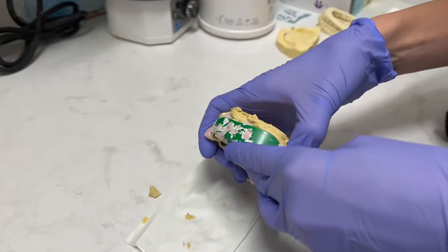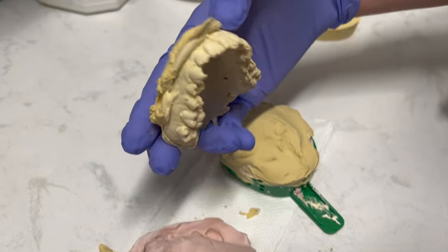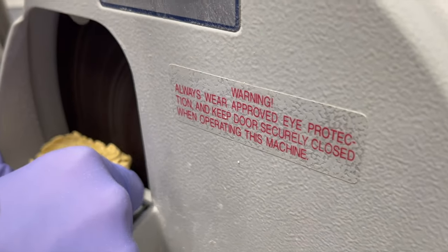Once it's cooled off, the model will be pulled apart from the impression. Then they will trim the model to get it ready for the vacuum forming machine.